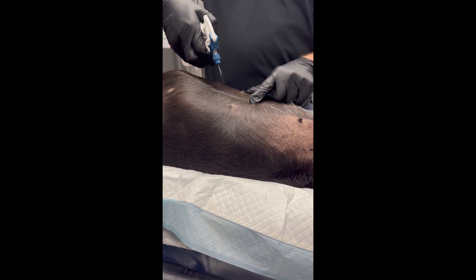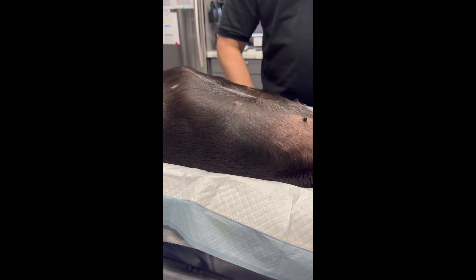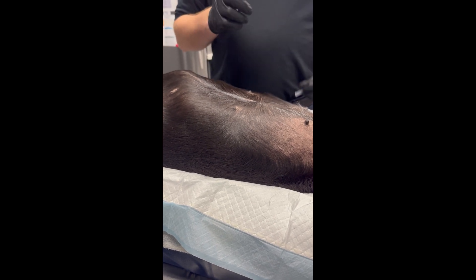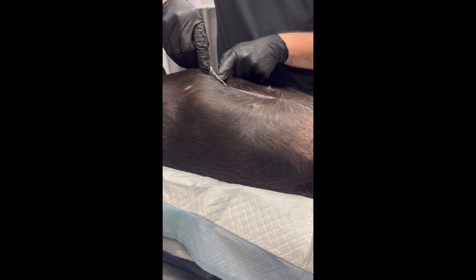I'm just going to apply a little bit of alcohol to the area. You don't necessarily have to clip, although you can. I already have my injection ready. With the point of that sternum, I know that the falciform fat pad sits there, so I'm going to go just caudal to that.